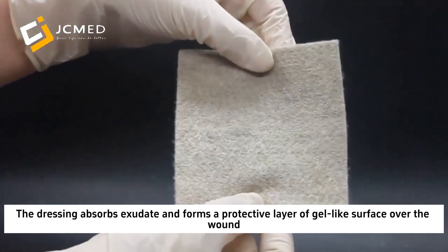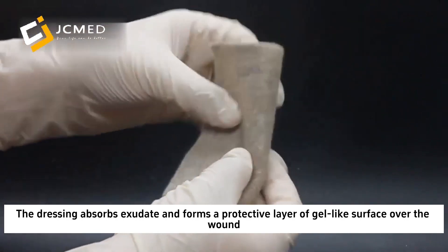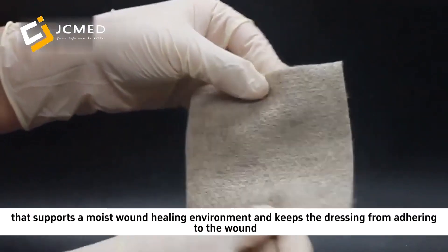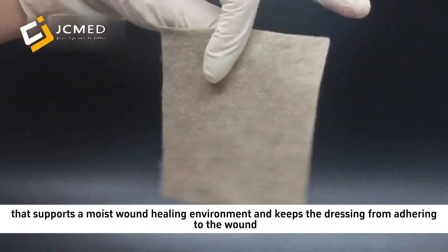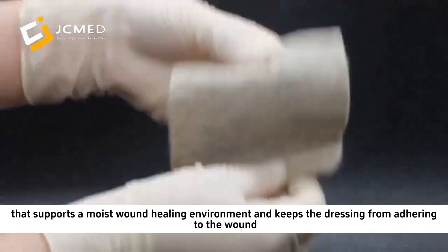The dressing absorbs exudate and forms a protective layer of gel-like surface over the wound that supports a moist wound healing environment and keeps the dressing from adhering to the wound.